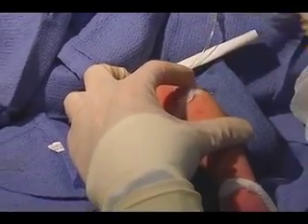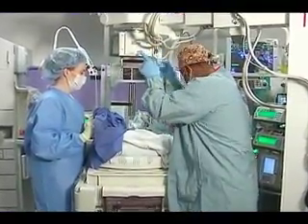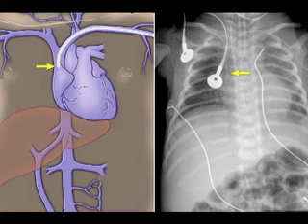Stabilize the catheter with adhesive skin closure strips and obtain X-ray film for confirmation of catheter position. The ideal location for the catheter tip is in the central venous system in the superior vena cava or inferior vena cava, just proximal to the right atrial junction. In this location, the catheter tip is most likely to lie parallel to the vessel wall, and the infusion enters the bloodstream at the point of highest blood flow. This is described as 1 centimeter outside the heart in a premature infant and 2 centimeters outside the heart in a full-term infant.